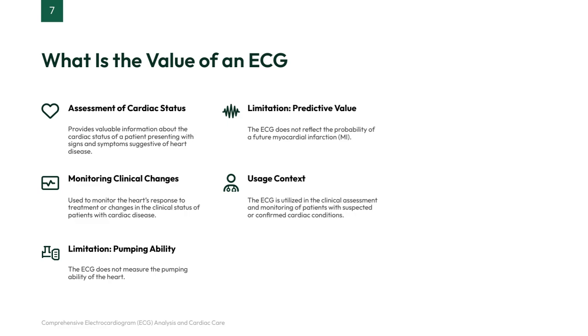Additionally, an ECG is a great tool for monitoring how the heart responds over time, whether to treatment or changes in the patient's condition. However, it's important to remember that an ECG has its limitations. For one, it doesn't measure how well the heart is actually pumping blood. That's a key function the ECG can't assess. Also, while it provides a snapshot of current electrical activity, it doesn't predict the likelihood of a future heart attack.